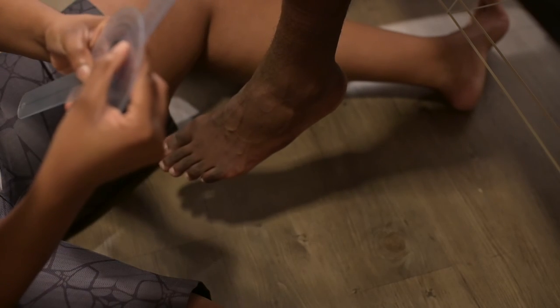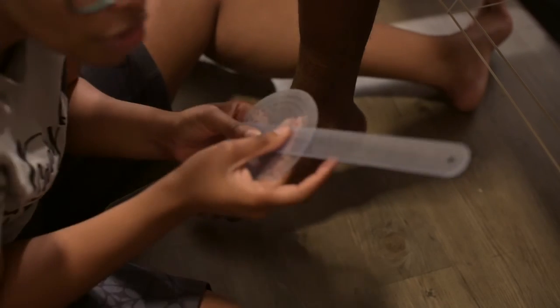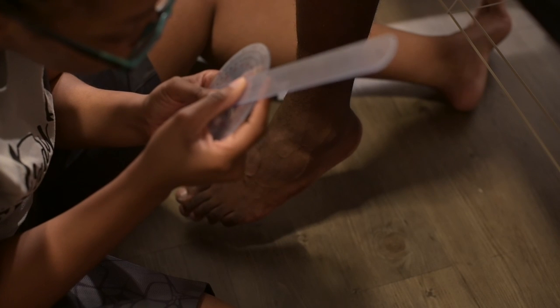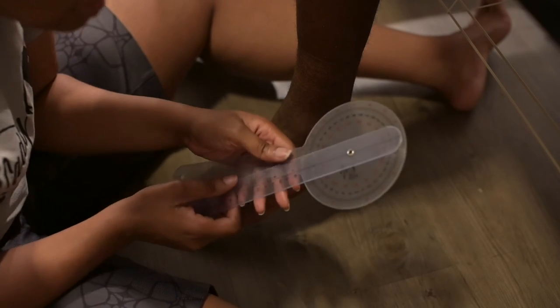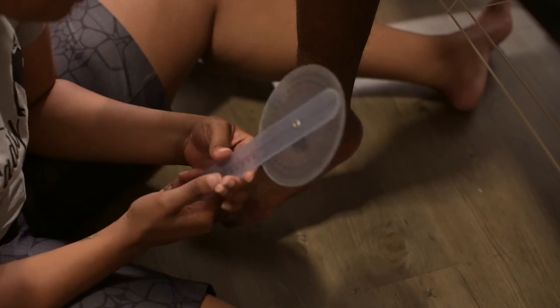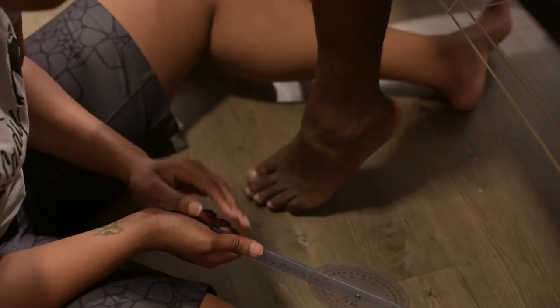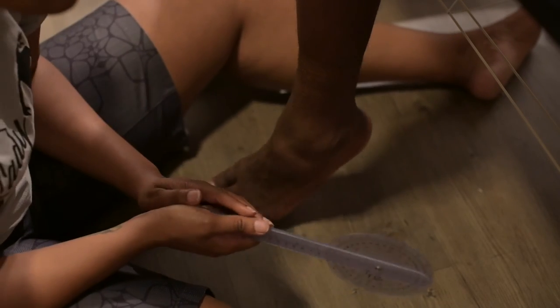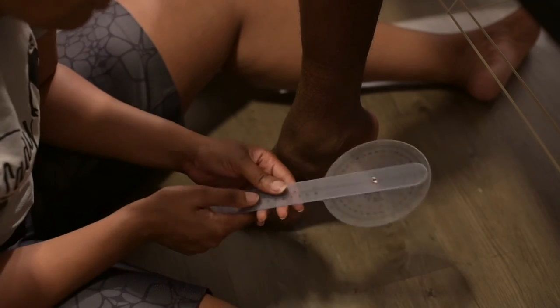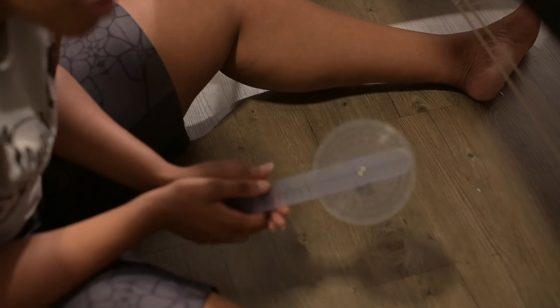Alright, so I'm getting the same. So maybe he's just weird, I don't know. But I have a measurement of 57 degrees of plantar flexion, which is over the top, and it could be due to altering the height of his thigh or his femur, which changes a little bit of everything since he's kind of tall. But the average range of motion for plantar flexion is 45 degrees.